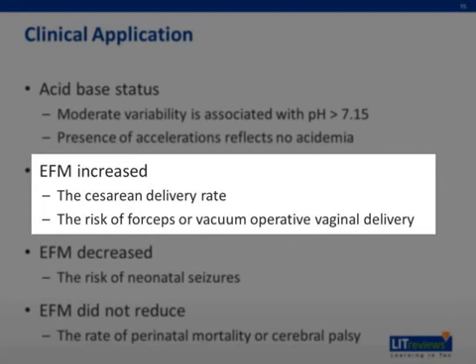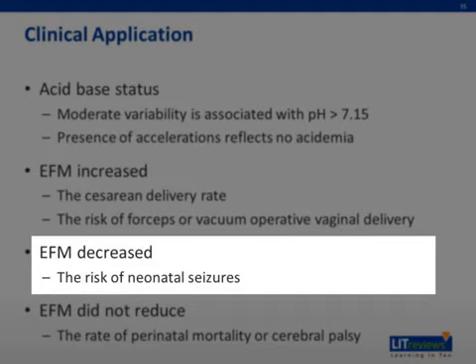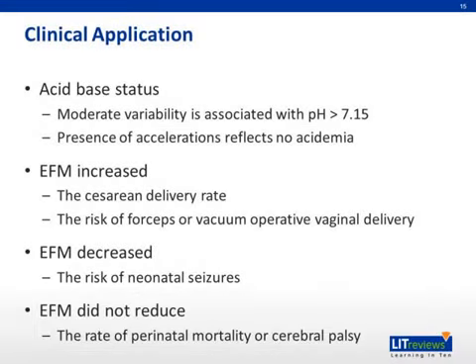The risk of forceps or vacuum operative delivery was also increased. Electronic fetal monitoring decreased the risk of neonatal seizures. However, it did not reduce the rate of perinatal mortality or cerebral palsy. The false positive rate for predicting cerebral palsy is 99%. Of note, 60% of women in preterm labor will have non-reassuring fetal heart rate patterns.